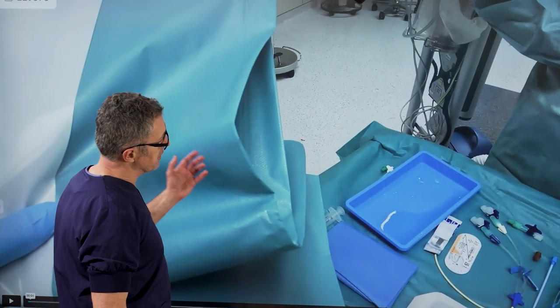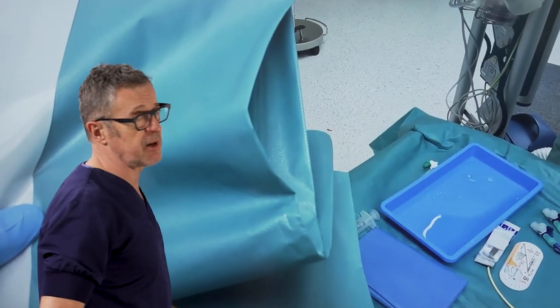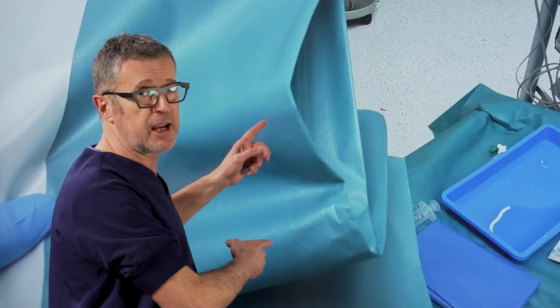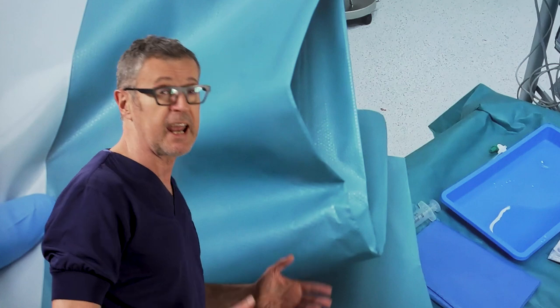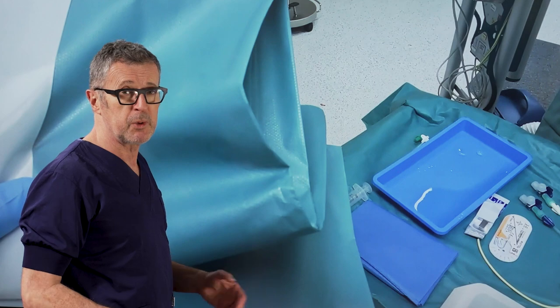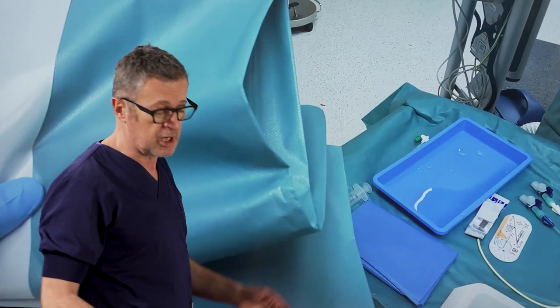Typically the procedure starts with preparing the tray, but now we also have to use sterile drapes to create a sterile field through which we're going to work. I absolutely hate these — they are like three pieces that are highly sticky and difficult to position and take off. So we're going to demonstrate how you can improve that process by using something we call the easy drape or universal drape, which also allows you to store the equipment.